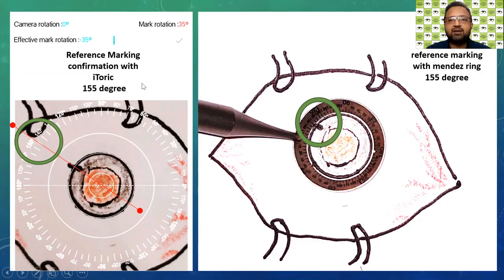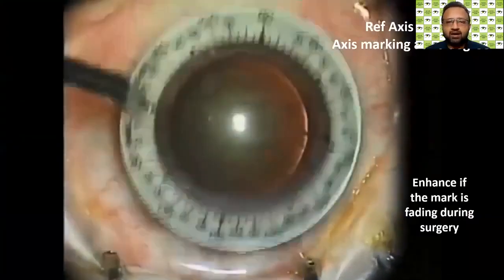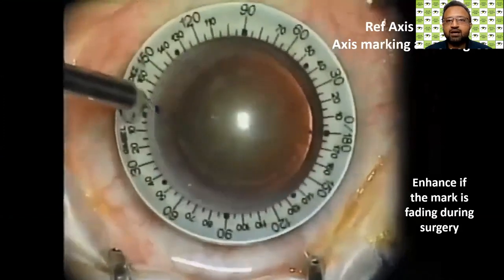So when I put the Mendez ring, my Mendez ring 155 degrees should be aligned with my reference marking 155 degrees. Then I will proceed to axis marking. Otherwise, the toric IOL axis calculation will not be correct. And this is the video of the reference marking.